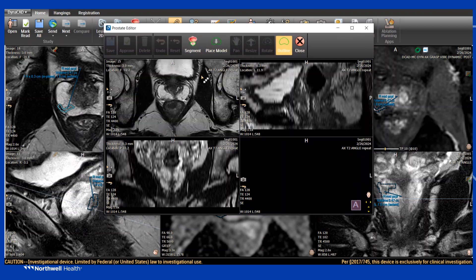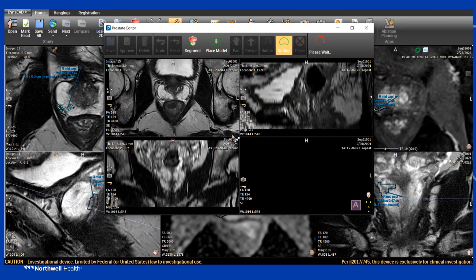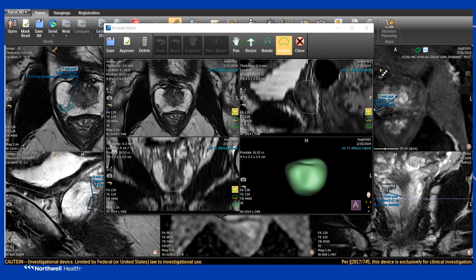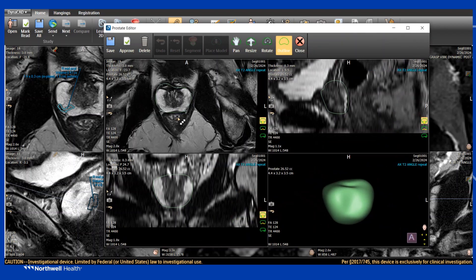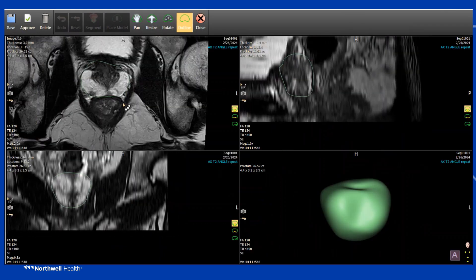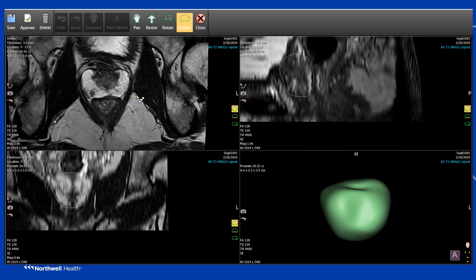First, click Segmentation if it's not already done — it lays down a basic outline of the prostate. This is where you have to fine-tune it. This is all in real time, not sped up. You see this green outline of the prostate — this is really important for the segmentation. Sometimes when I look at the T2, I'll find lesions here while doing my segmentation. You can see it's clearly off, so let's correct it.